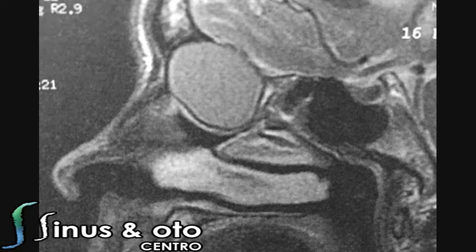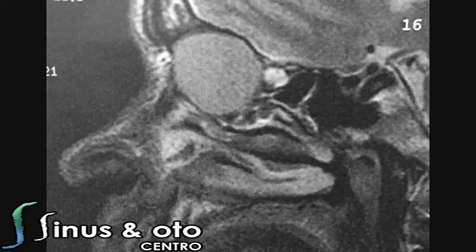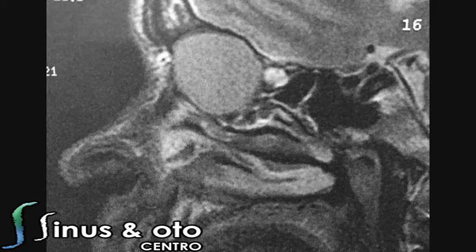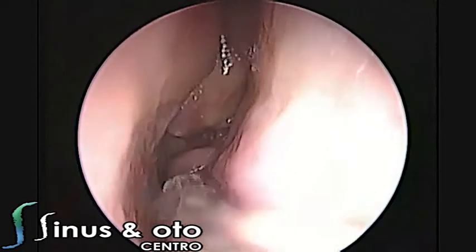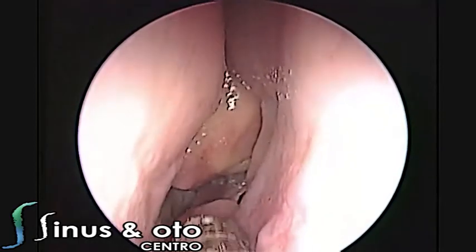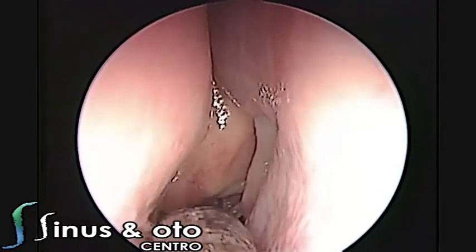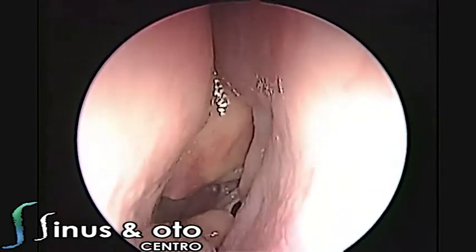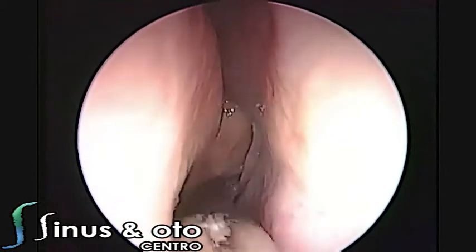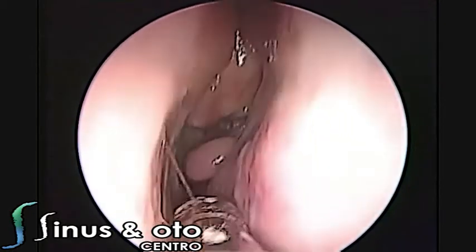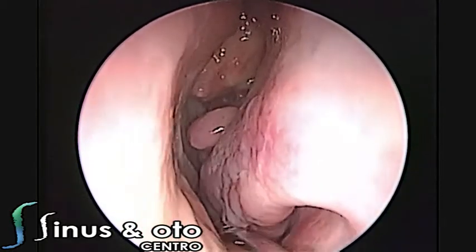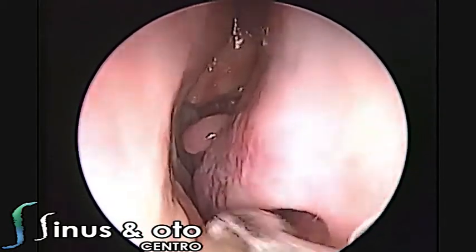The lesion is completely outside the brain. So we decided to do this endoscopic approach in order to marsupialize this mucocele, in order to open the contact and to alleviate the symptoms of the patient.